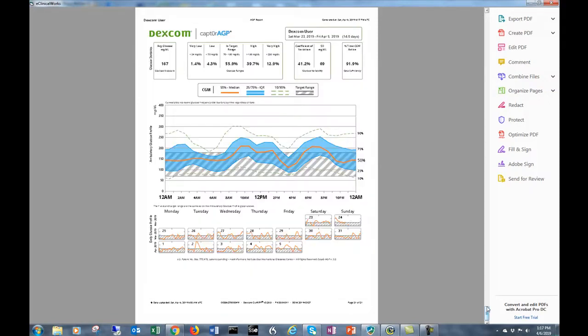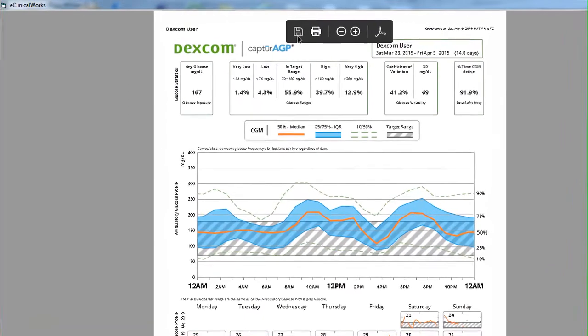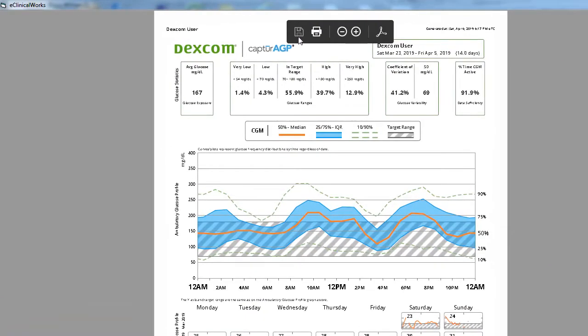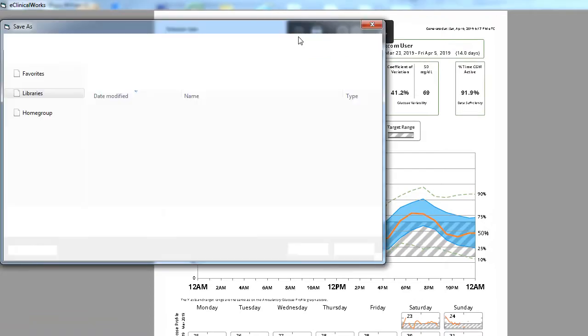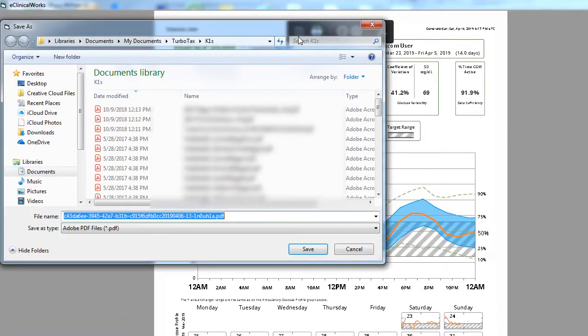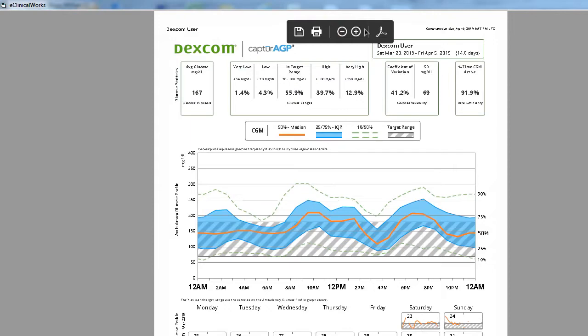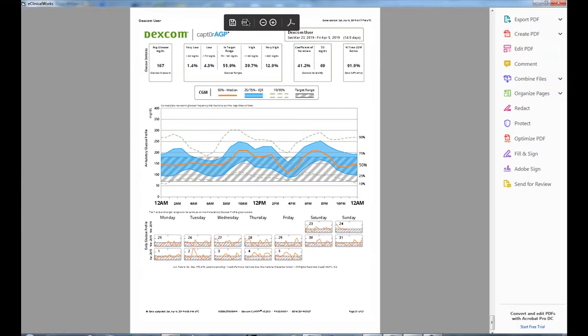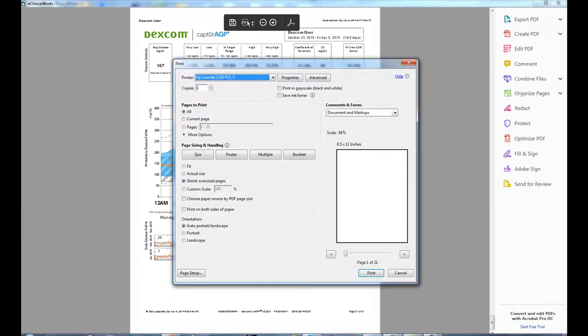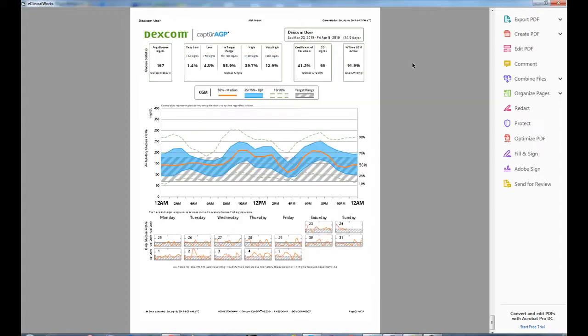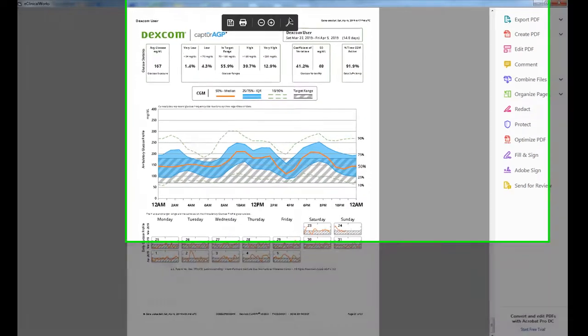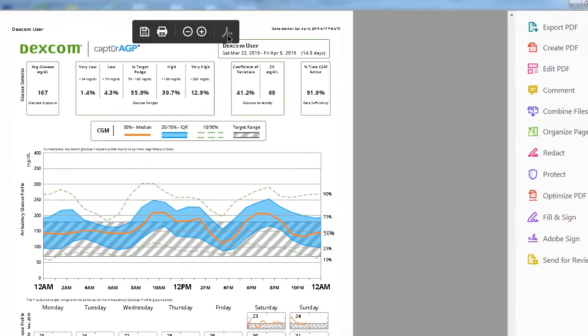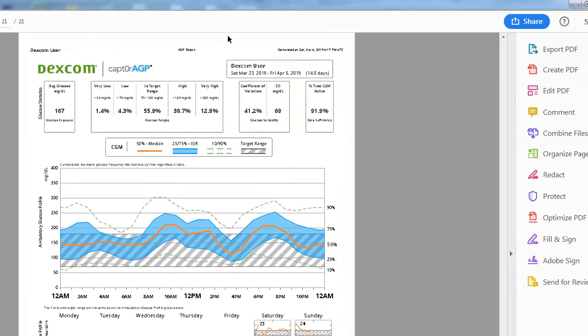Once you've reviewed all of the reports, you can then choose to print them out or save them to disk. If you save them to disk, it's got a random hash of numbers, so you need to change that to something you can use and then attach to the patient's chart, or you can print it out. Note that when it prints, it's de-identified, so it doesn't have the patient's name or their device serial number on it.